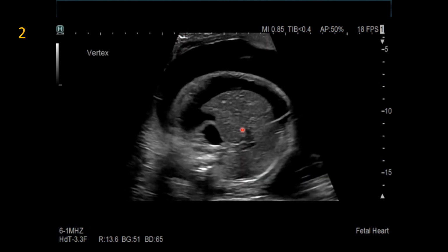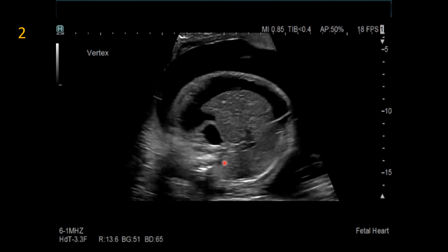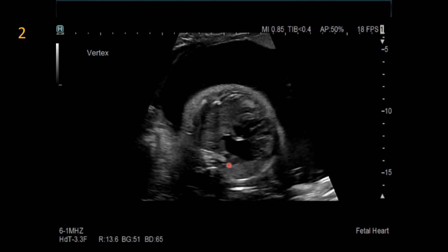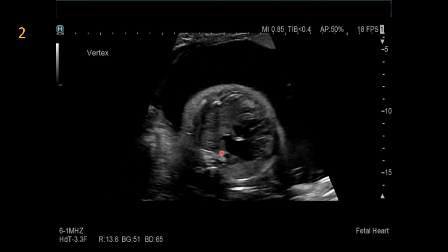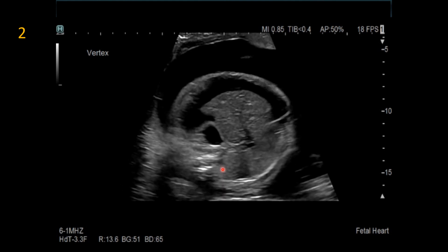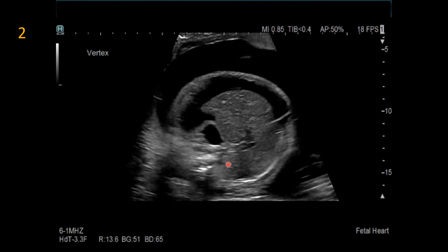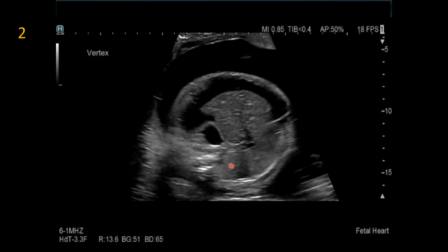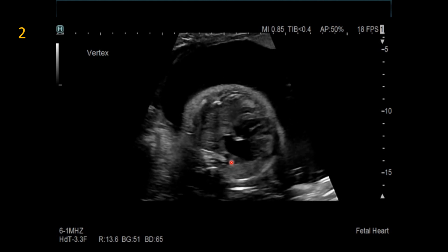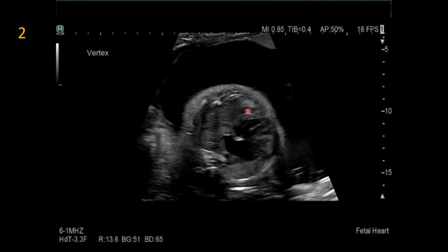Looking closely, here's the liver. Again, the heart is in the right chest. If you look at the spine, you can see here that there is the double barrel appearance of the aorta and the azygous vein in this case, the dilated azygous vein, cluing you into the presence of interruption of the intrahepatic portion of the IVC with azygous continuation, again heart block, and really massive ascites.